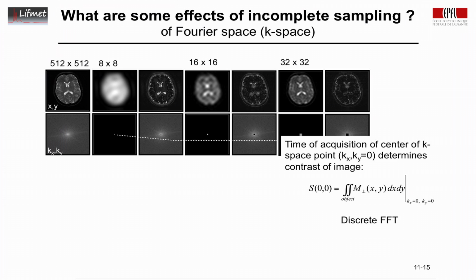If we look at the discrete Fourier transformation, we employ the fact that it is periodic over the sample time period, and we can do a time shift. So here's the signal, that's the echo that we record. In discrete Fourier transformation, this signal is going to be the same in magnitude as this signal.